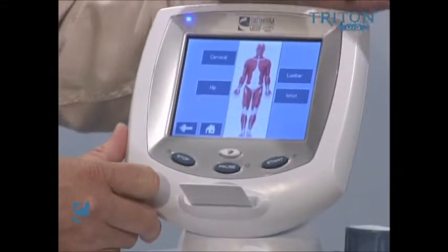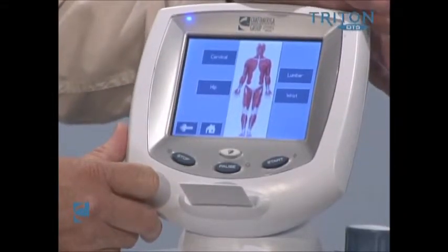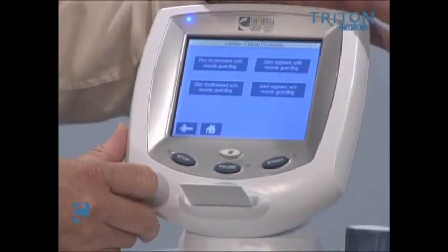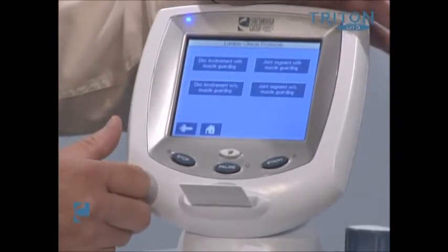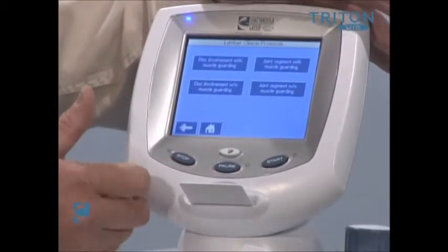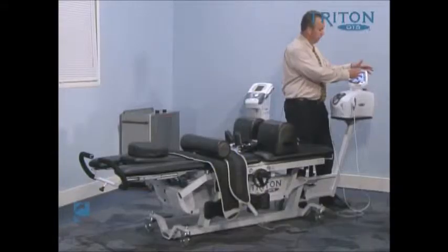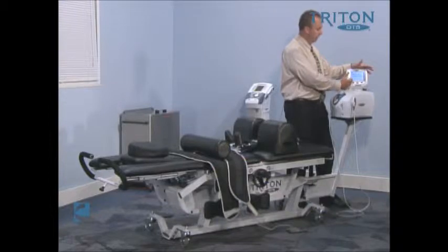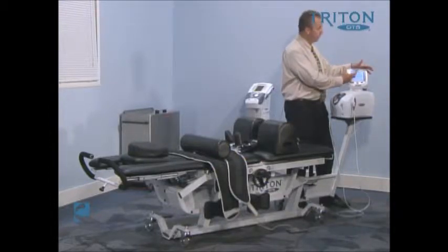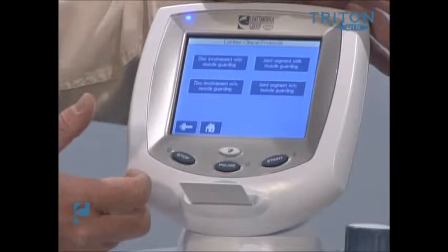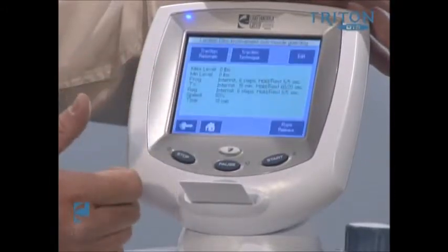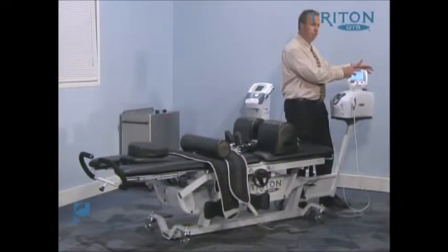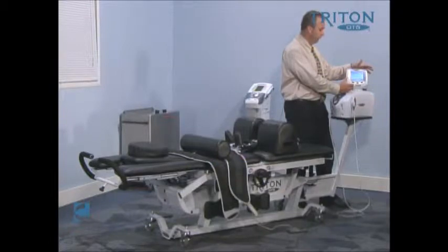The most basic process you can go through here is using the pre-programmed protocols, essentially touching on the area of concern. For instance, if we're going to do a lumbar traction protocol, it brings us to another screen that gives us options describing our patient presentation. We would choose the presentation that best describes their particular condition.